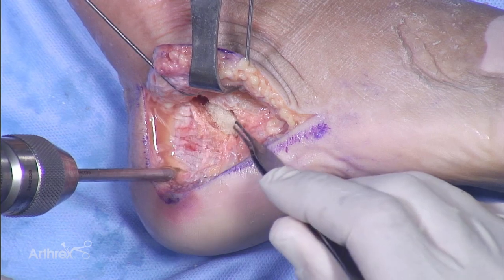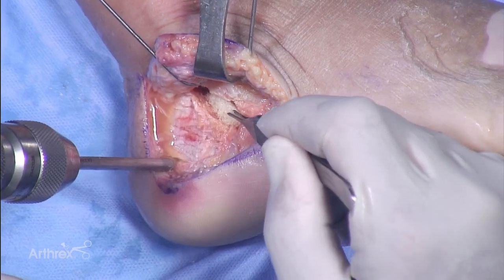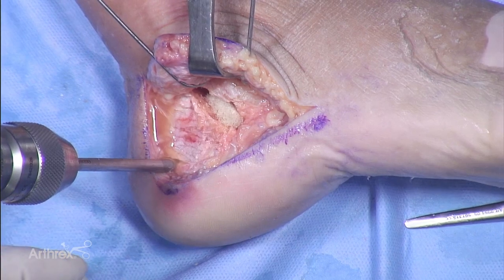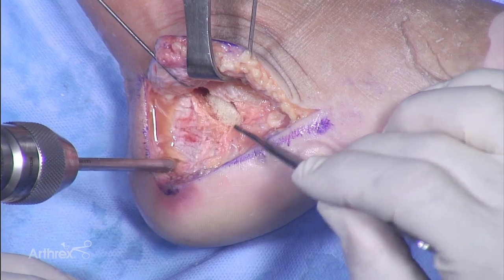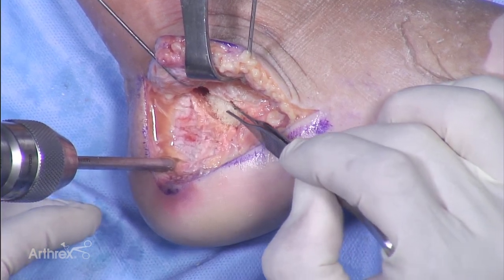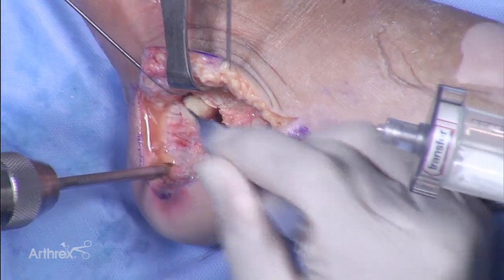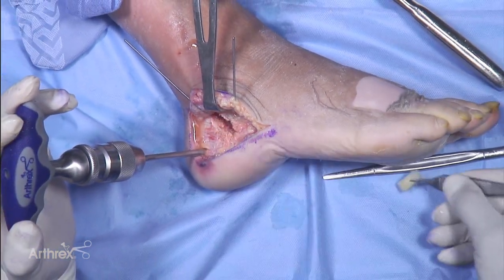The clock is running — I probably have four or five minutes before the sponge becomes hydrated and gets softer. Once you have placed your plate, the FlexiGraft sponge just becomes bone graft. It has both osteoinductive and osteoconductive properties, so it's a perfect material to have in that area to help with bone healing. As you can see, this sponge is still hard, which would have done a very nice job.